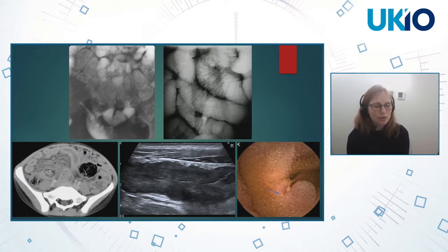You can get beautiful distension of the jejunum with enteroclysis. This is a barium study on the top right, which is a classic example of that slinky type appearance you can get in scleroderma. But again, we tend to use MR if we're going to be doing this rather than barium these days. CT is a very valid alternative, particularly in older patients. And that may be CT enterography with contrast, or in the acute setting, actually maybe just a standard contrast enhanced CT study, depending on the patient.